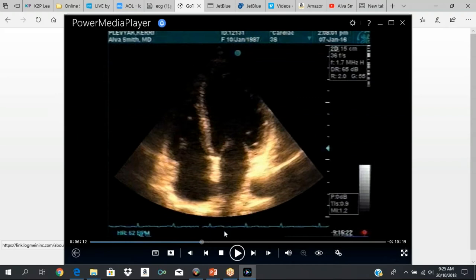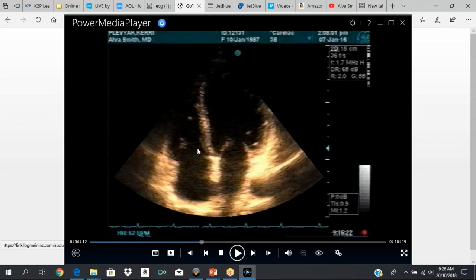Apical four-chamber view: LV cavity, left atrium. This is the anterior mitral leaflet and posterior mitral leaflet. Your descending aorta is right there. This is your atrial septum, right atrium. Your tricuspid valve is right here — this is the septal leaflet of the tricuspid valve and the anterior leaflet. This is your ventricular septum. This is the RV, right ventricle.